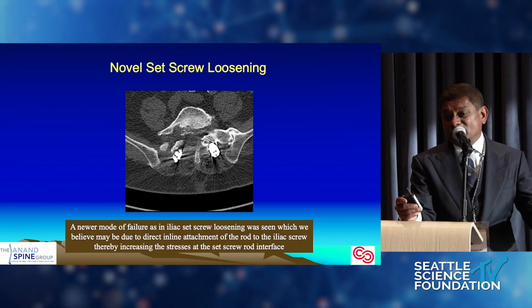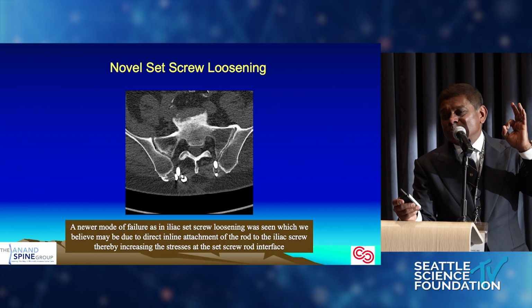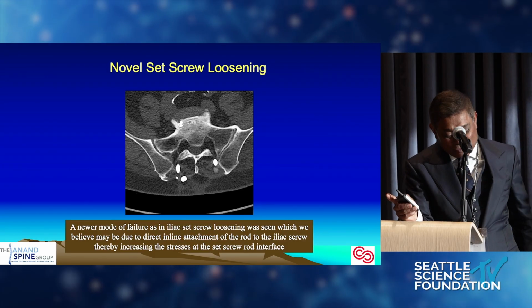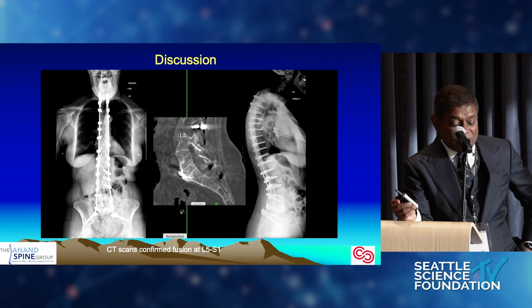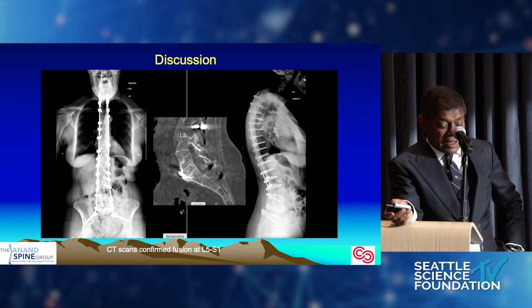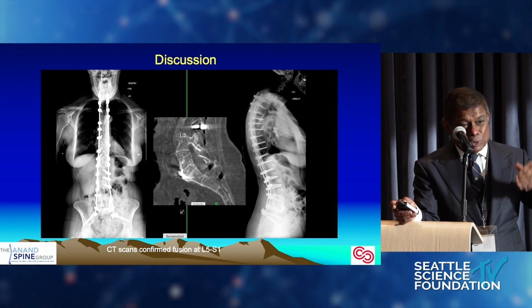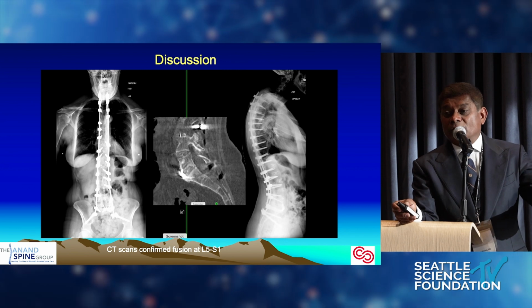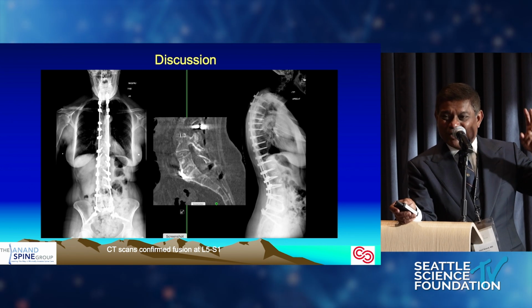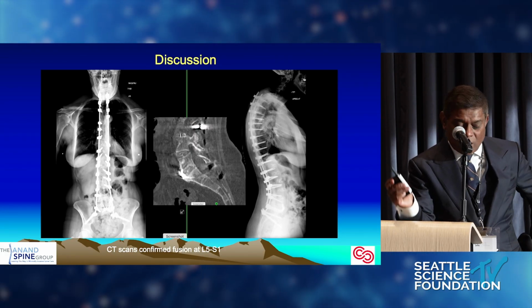And the last is, now essentially, we see the cap coming out. The cap actually drops loose. Interesting. Instead of the screw breaking or the screw getting loose, the cap gets loose at the ilium. And this we've seen at least about 6 to 7 times now. And we see incidentally 5 out of 7 are totally asymptomatic. And if the rod breaks, it breaks below L5-S1 after L5 is fused. But that's the only place the rod is inclined to bend, by the way. These are 5.5 titanium rods. 5.5 titanium, one more time. 5.5 titanium rods for 22 years. Instead, what are we doing? 5 and 6 rod constructs every day.